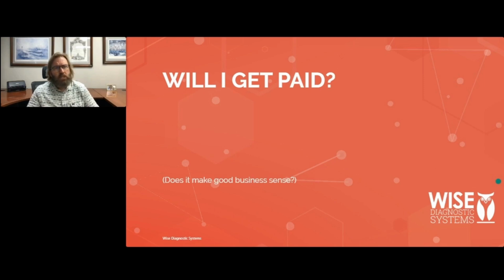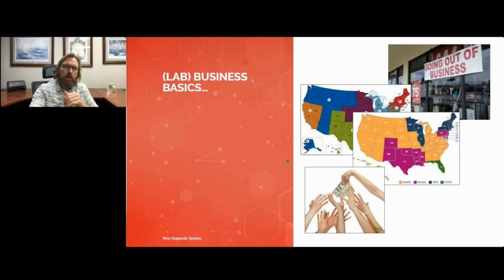And it's a little bit difficult too, because you have to do a lot of front end work to call your payers, review the CMS fee schedule. It does take a lot of research just to feel good about what you expect to get paid on it. And does it exceed what your cost will be for it? Not just for putting it on the platform, but potentially the additional rent that goes along with a larger space, if you have to take on an equipment loan, and those type of factors. So this is what I just put together as simple lab business basics.